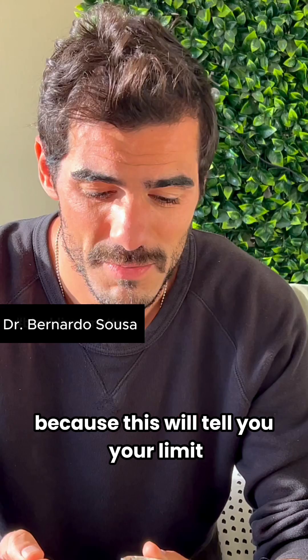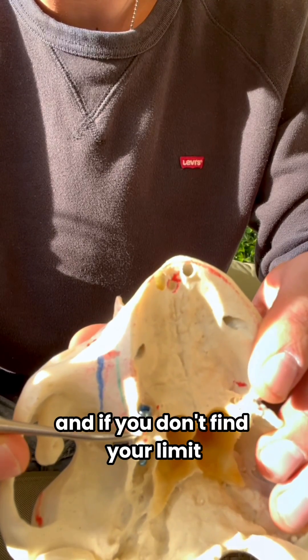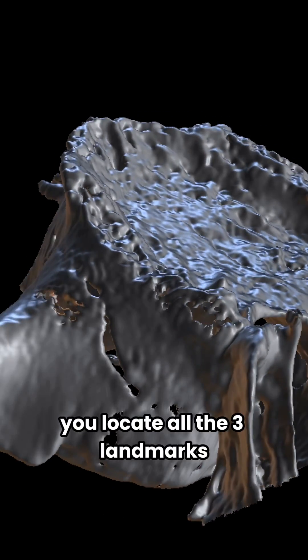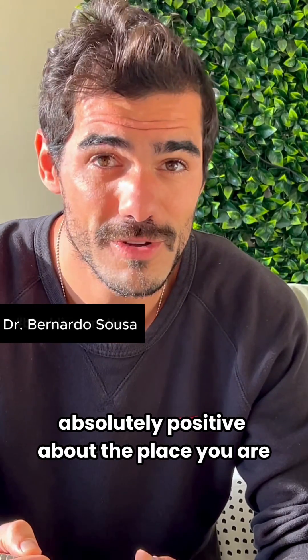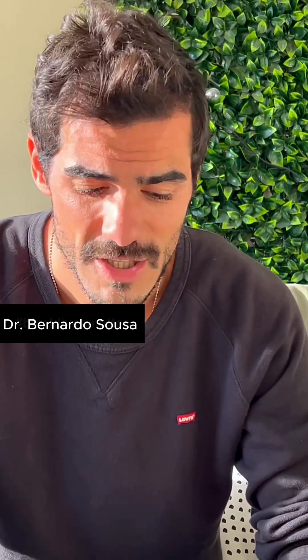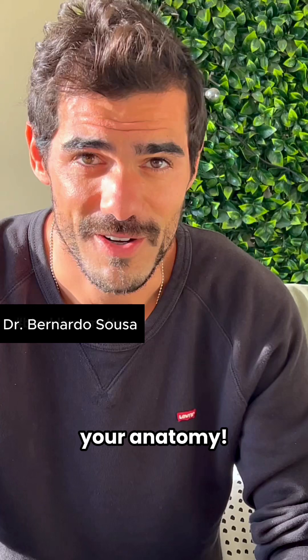This is just one of the three landmarks, but it's a very important one because it tells you your limit. If you don't find your limit and you don't know your anatomy, you are going to be in trouble very soon. Make sure you locate all three landmarks and are absolutely positive about where you are, and your pterygoid surgery will be super easy. You don't even need to take an x-ray — but you do need to know your anatomy.